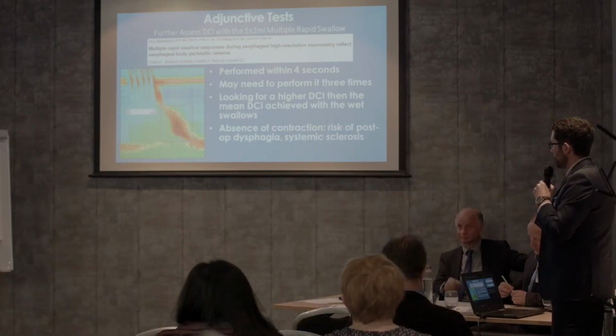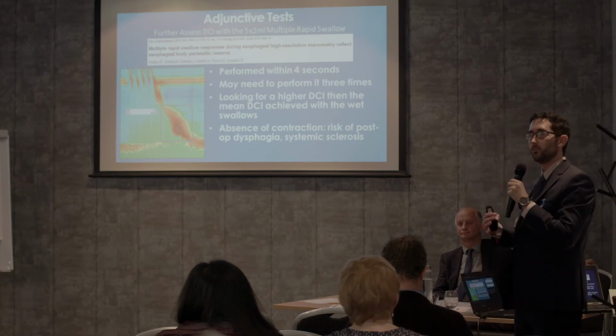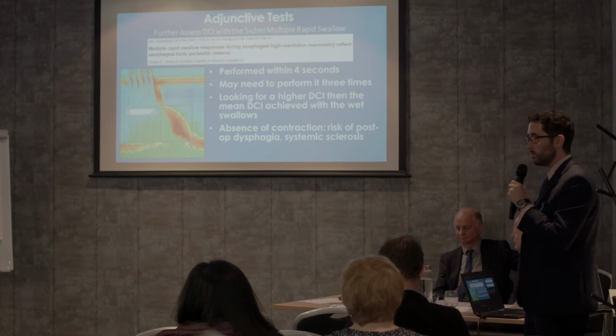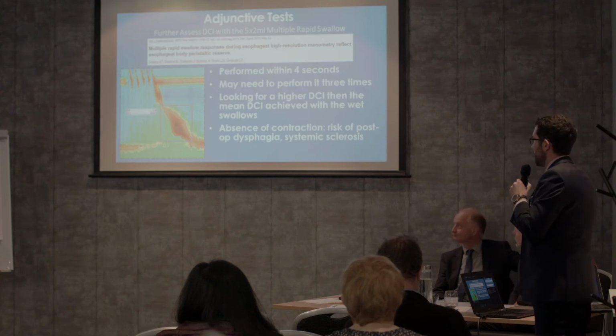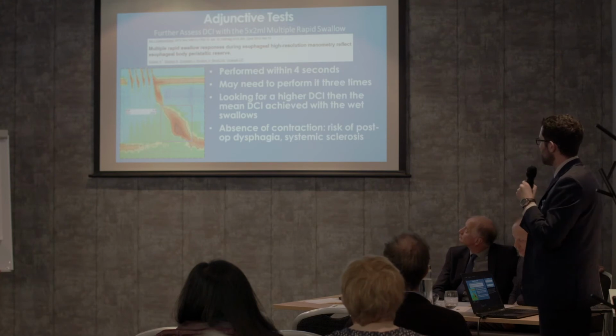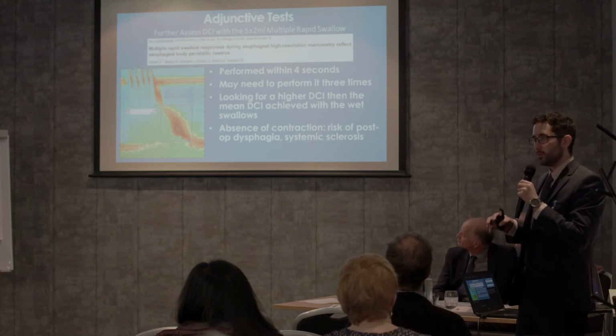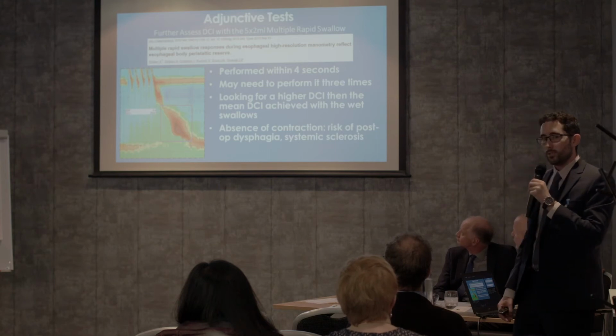And conversely, an absence of the contraction could suggest that there is increased risk of dysphagia when they go forward for anti-reflux surgery. And it is the most common feature in scleroderma. However, just be careful that if you are going to report that there's been no response, the authors suggest that you do it at least 3 times.